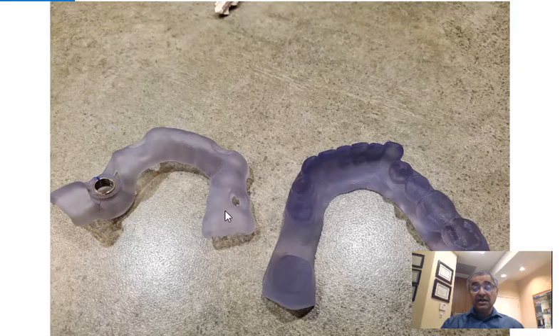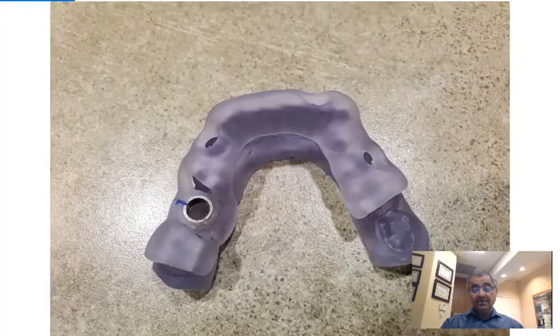That surgical guide, if you look at that silver opening, let me show this, fits over the model, and it fits inside the patient's mouth. That controls the angle, the depth, and the location of the implant. So it makes it a very safe implant placement.